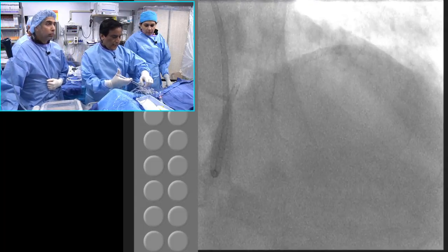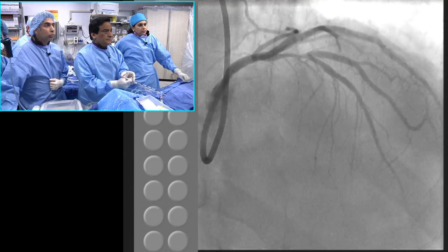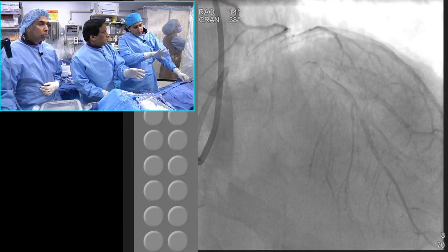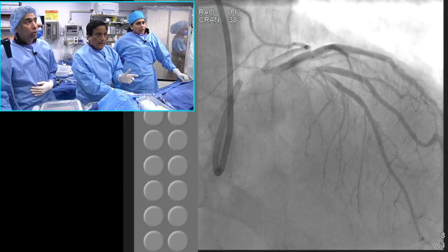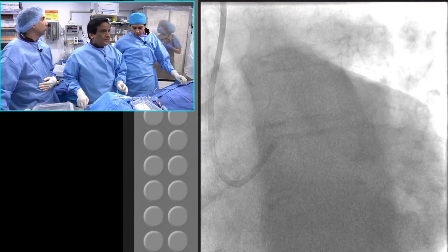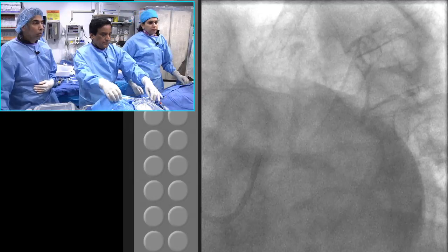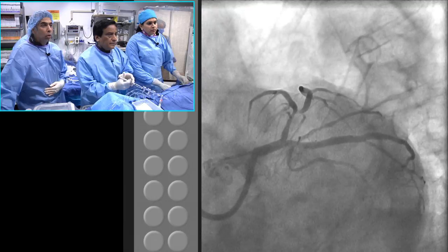So we are ready here, and now you want to see the LAO caudal to really see how proximal we should bring it. Caudal, yes, because I think we have to come up to the ostium. Look at the length of the LAD stent. Give one nitro. We have emphasized that we are going to use two dedicated stents. One second. Two stent strategy. Yes. Ready? Pull back the guide that way. Pull the guide line, right. Wow.